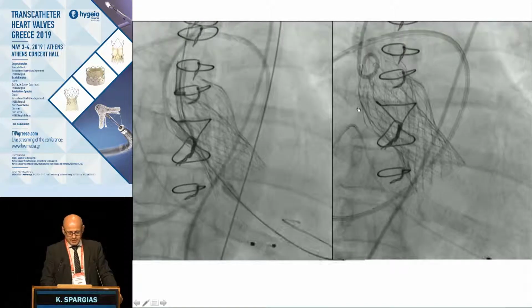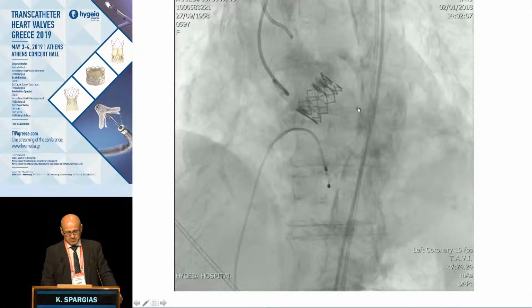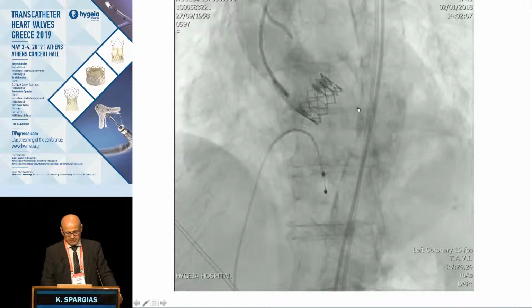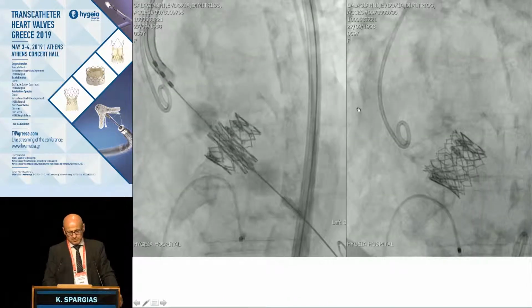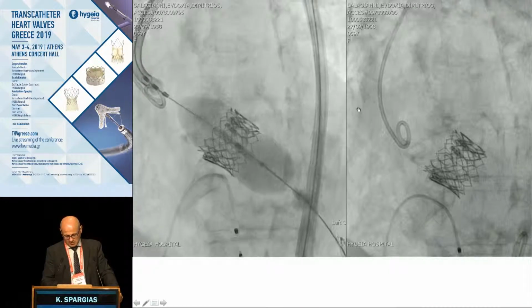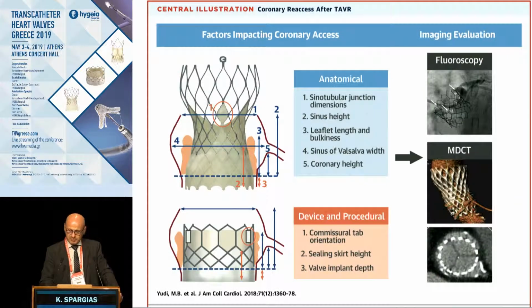reversed. And finally, a valve-in-valve in a Sapien valve, again a patient on hemodialysis that had an early degeneration and came back, and we positioned a Sapien within Sapien. So this is the case that nothing really changes in the anatomy there with a Sapien valve.